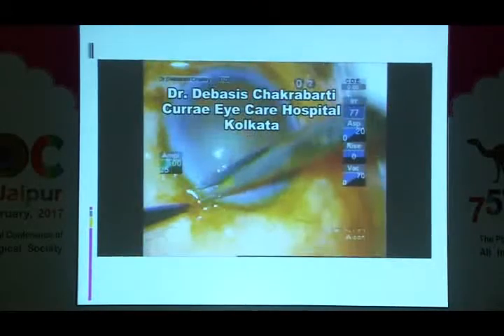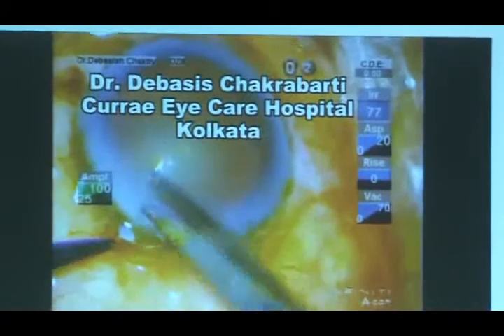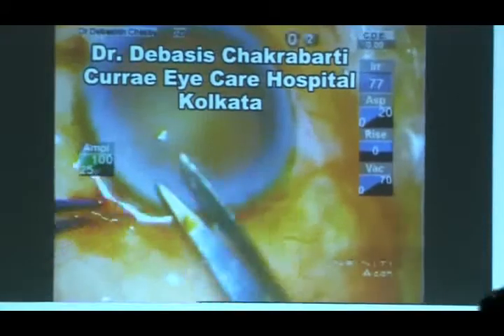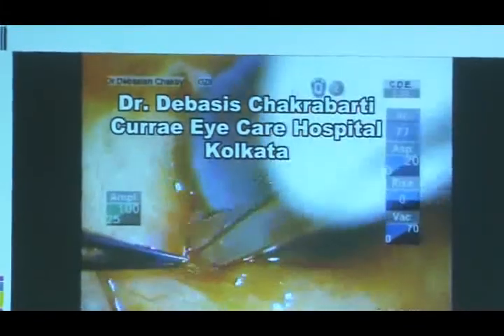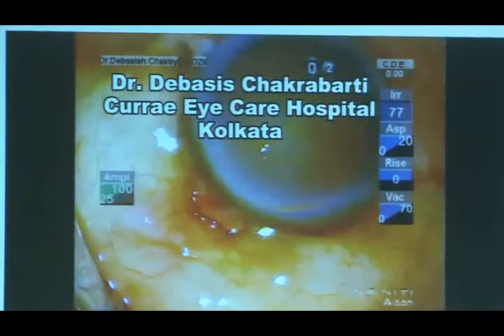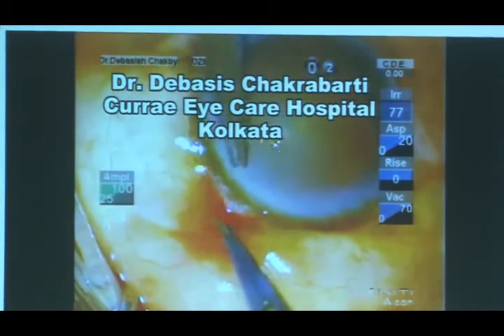So after the superior rectus bridle suture, the important step is the conjunctival dissection. As we have discussed in the anatomical part, the conjunctival dissection must be meticulous. One should try to go beneath the Tenon's. Identify the junction of the insertion of the conjunctiva and the Tenon's, and with your non-dominant hand, hold the conjunctiva and Tenon's together and then go beneath this conjunctiva-Tenon's complex.